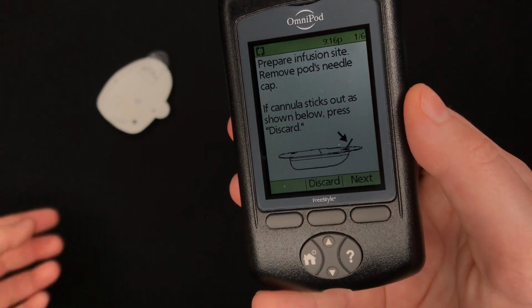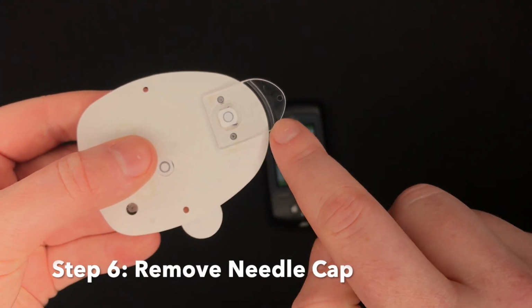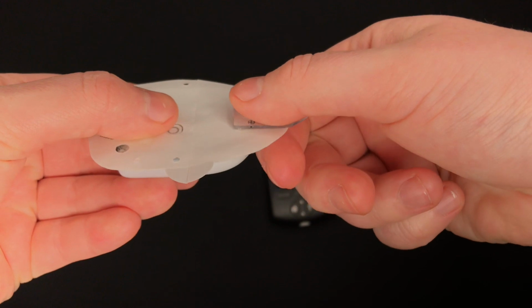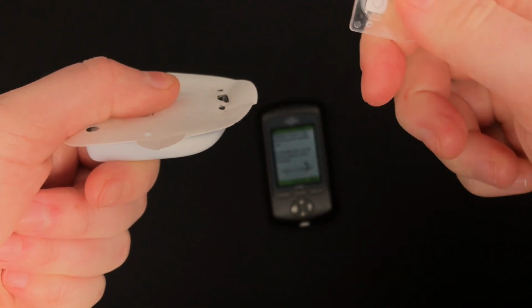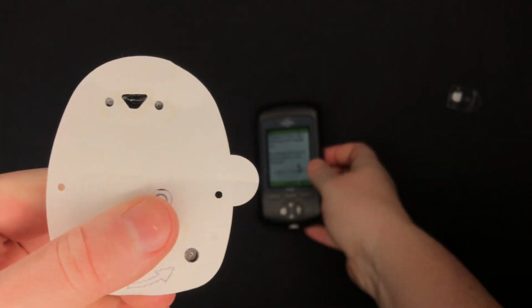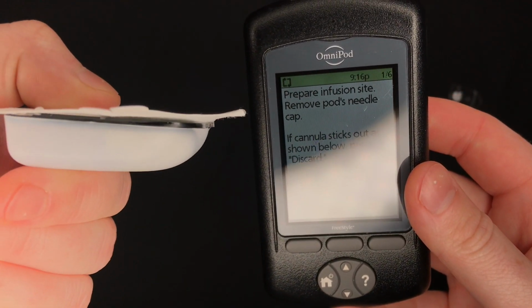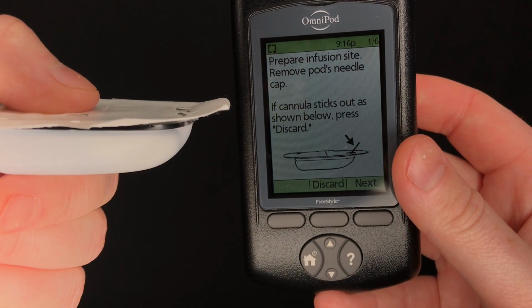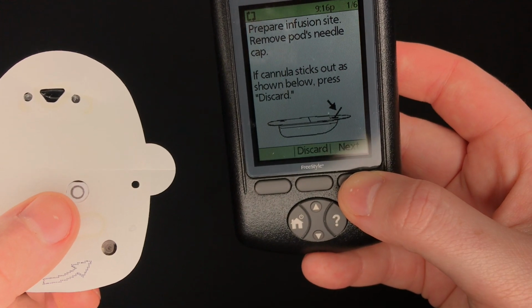The next step is going to involve removing the needle cap. The needle cap is this hard piece of plastic that covers where your needle is going to come out. Just put your thumb and your index finger around it and pull up hard. It's going to feel like you're breaking it, but trust me, you are not. You're going to want to make sure that there is no needle sticking out at this time, because that can show that there's a malfunction in the pod.